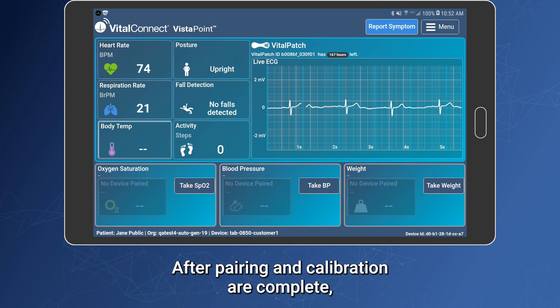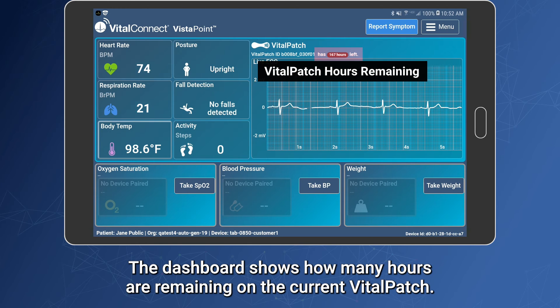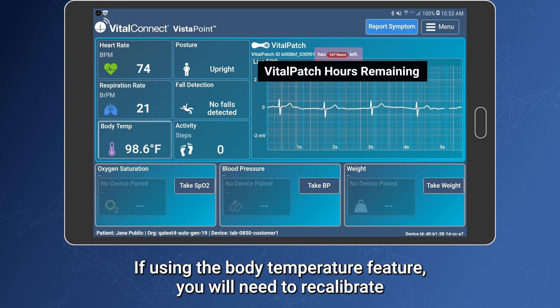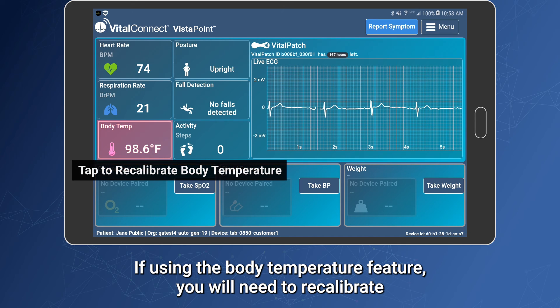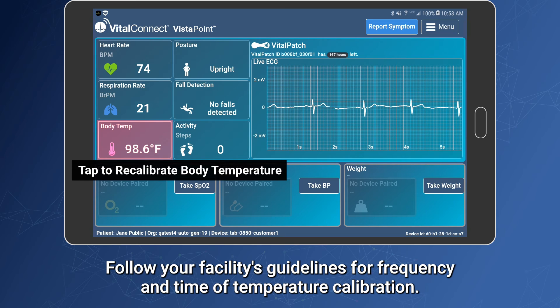After pairing and calibration are complete, you will be shown the patient's vital signs on the dashboard. The dashboard shows how many hours are remaining on the current Vitalpatch. If using the body temperature feature, you will need to recalibrate the body temperature at least once per day during the monitoring period. Follow your facility's guidelines for frequency and time of temperature calibration.